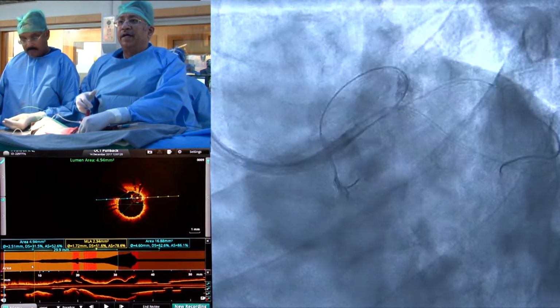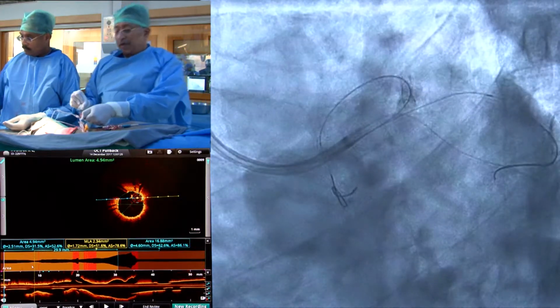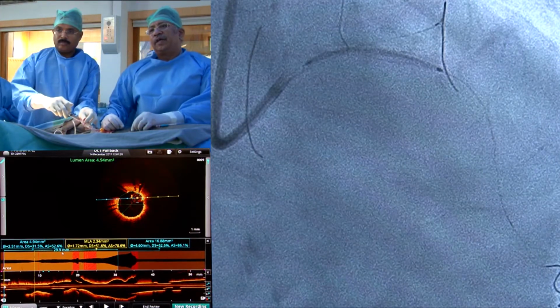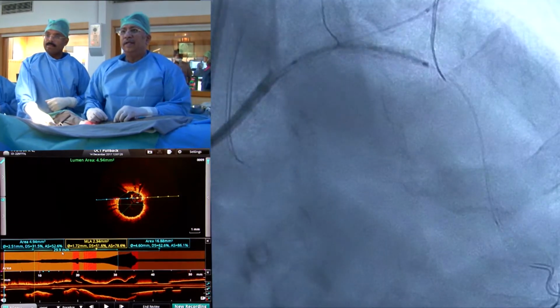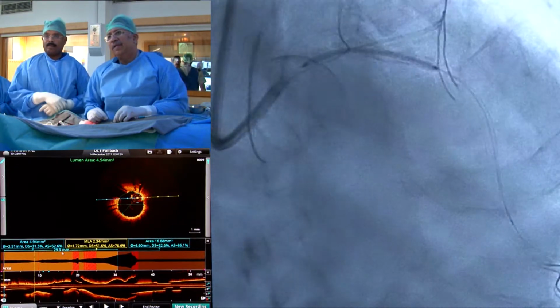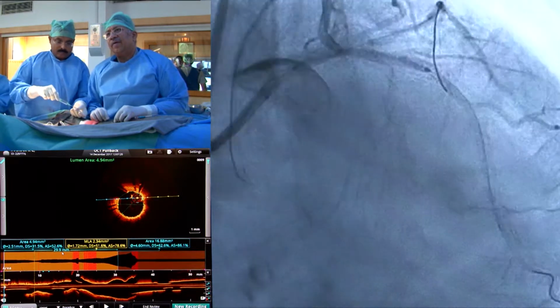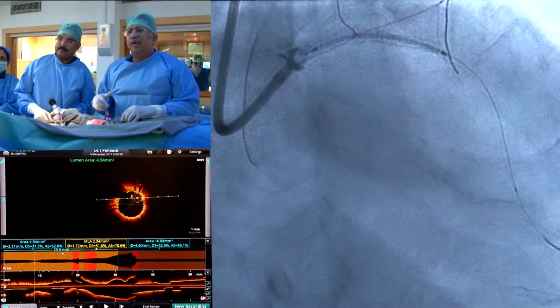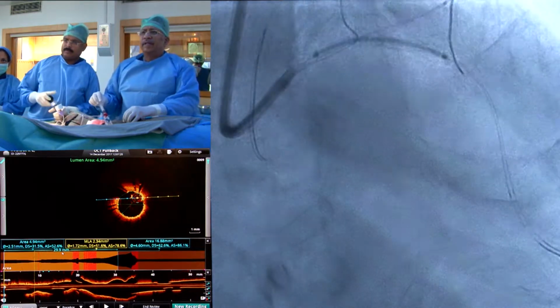This is what we get post dilatation of the left main, and now we're going to do a crossover stenting from the left main into the LAD. So now we have positioned the 3.5 by 33 stent, and let's just check the position. That seems to be quite acceptable. I think distally it is just crossing the pre-existing stent. Or I think we should move it a little distally. So we moved it a little more distally, and I think this may be a little more optimal position. Right, let's go up.